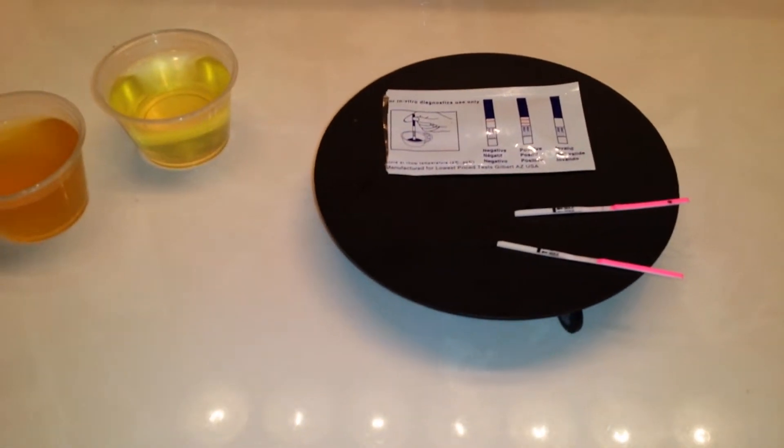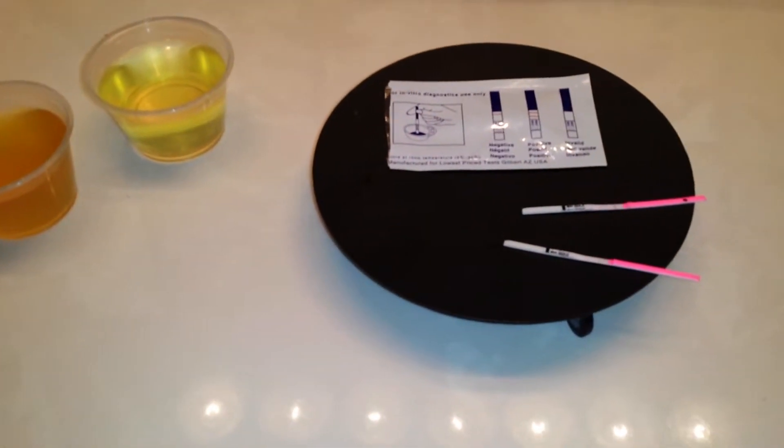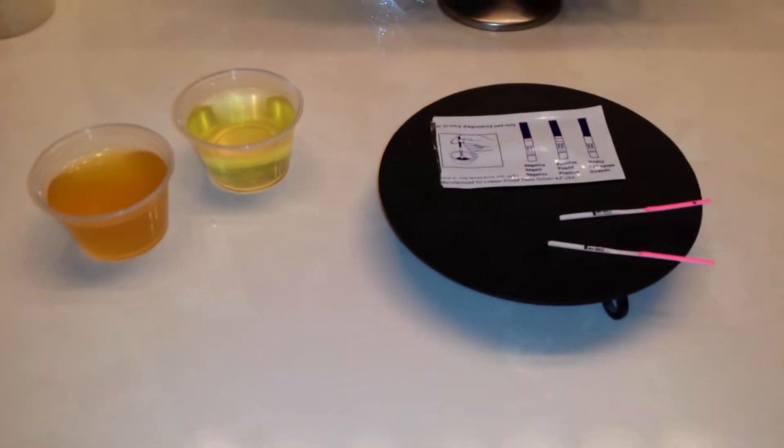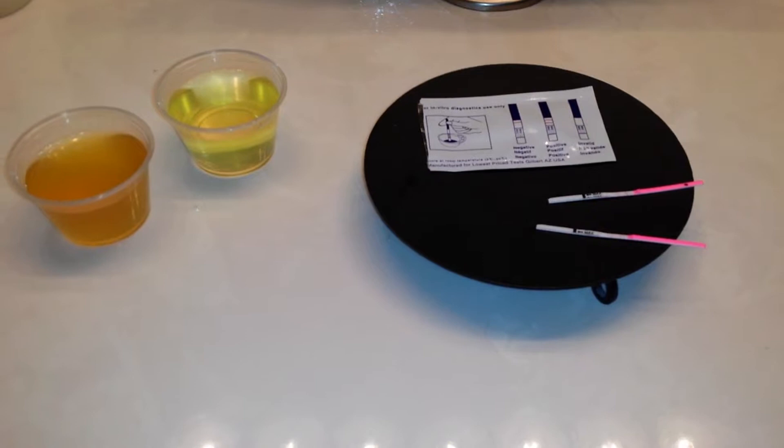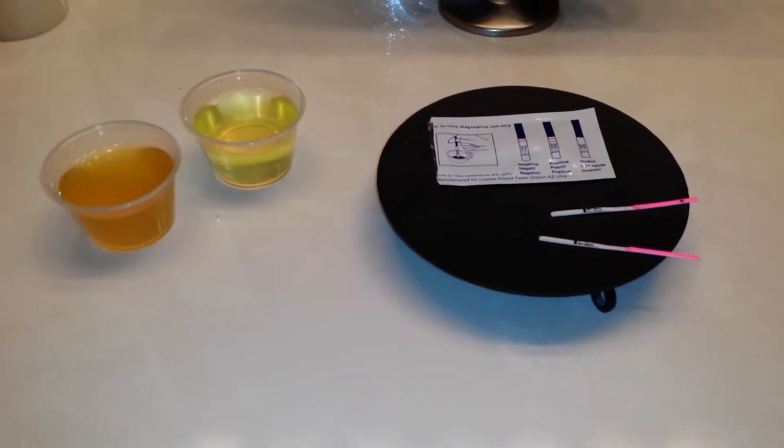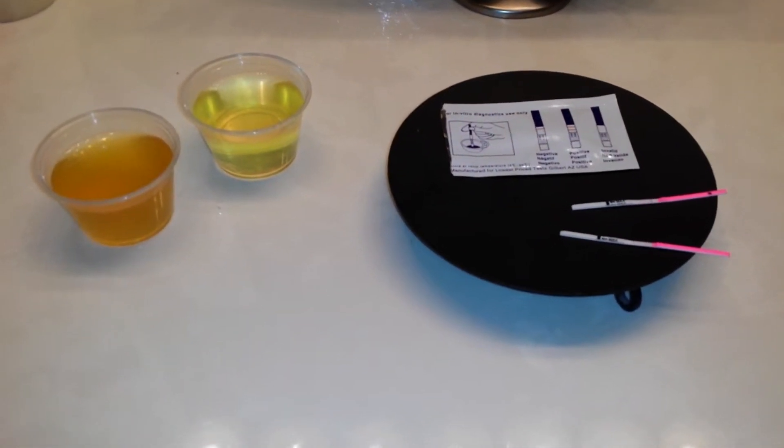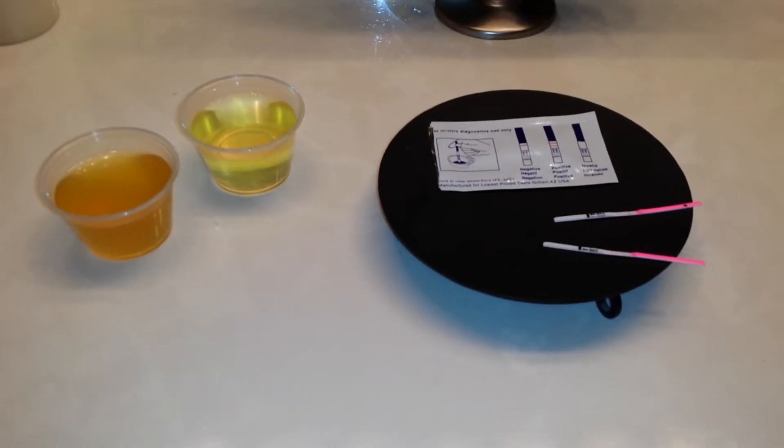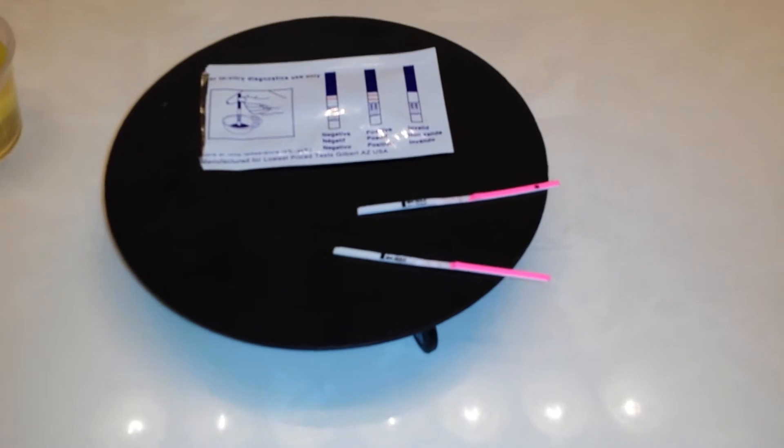Now essentially the way this works, we have this luteinizing hormone that's constantly running through our system and just a day or two prior to ovulation, we get a surge. And the way that the sticks work is they detect an increase in this luteinizing hormone, which we call an LH surge. Now these are 40 MIU.